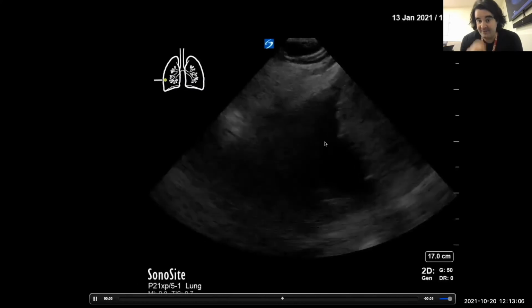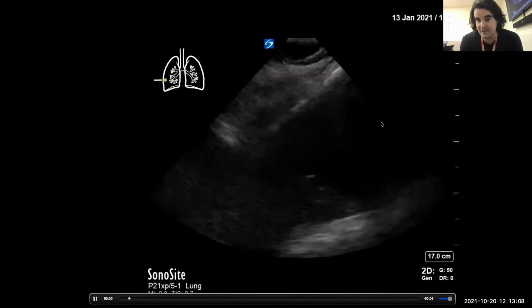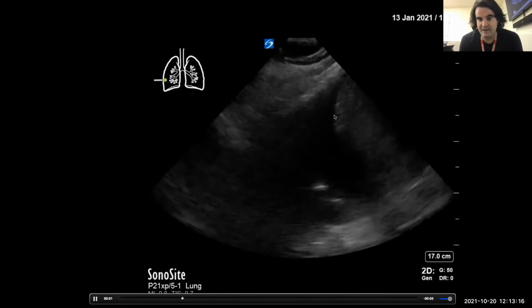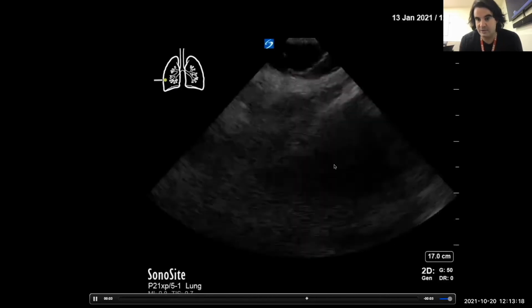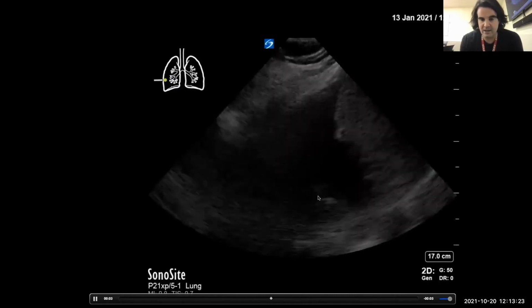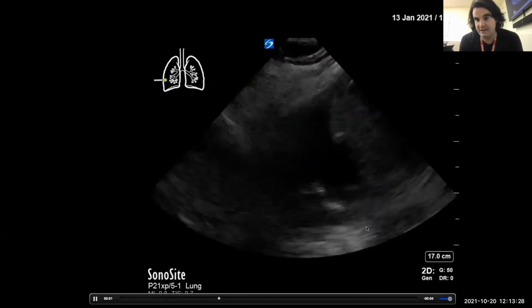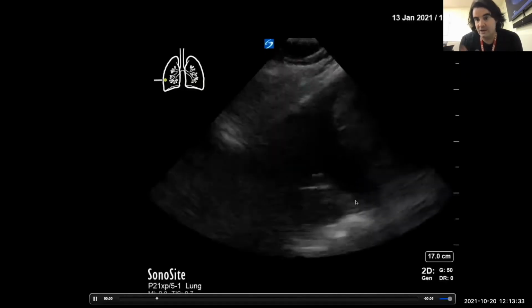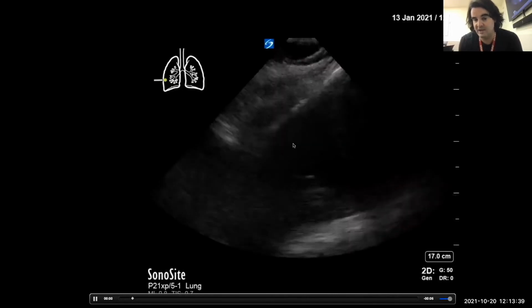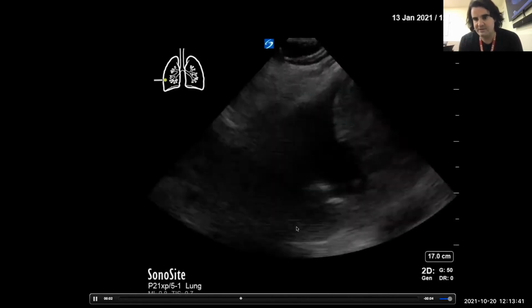And you can see that's quite likely the liver, which is recognizable by its fairly homogeneous and gray texture. And then there's a hyperechoic rim along that liver, which looks like it would probably be the diaphragm. Okay. And then here, quite likely the lung, but not ideally seen. And then this would be the spine. So generally we don't see the spine above the diaphragm in an inflated lung, because the inflated lung will block penetration of sound waves, and you'll just more or less see the white shimmering pleura. So normally you don't see the spine.